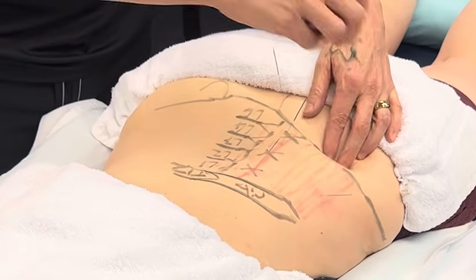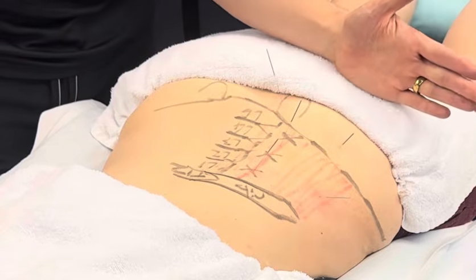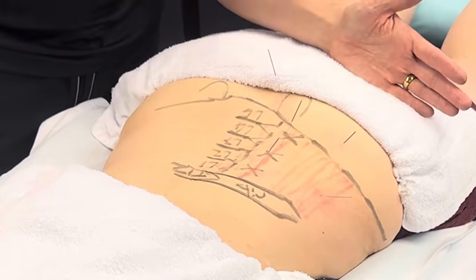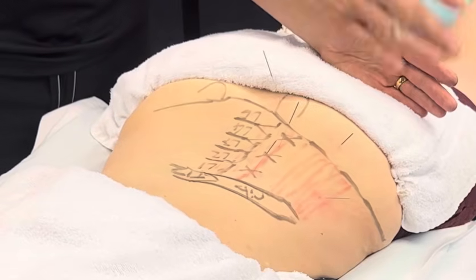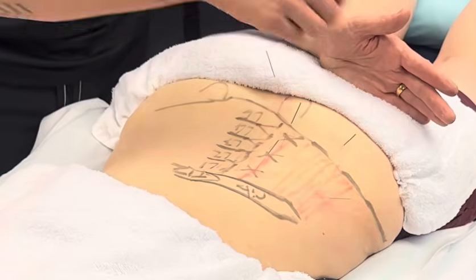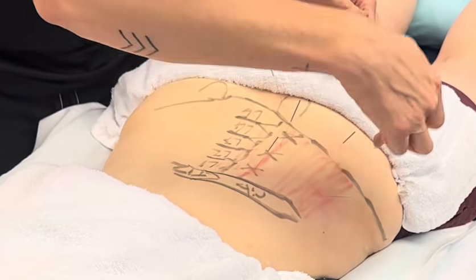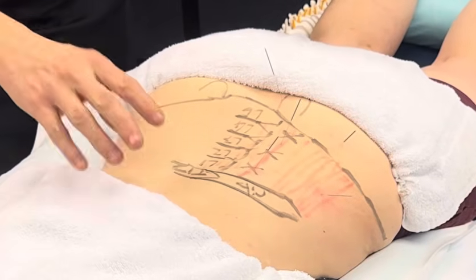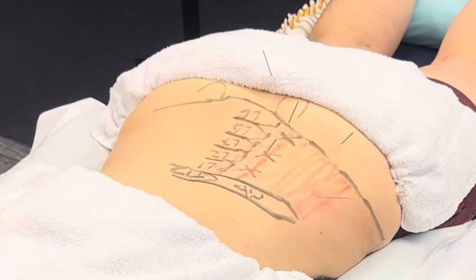and then I'm just going to bracket it and needle down until you get halfway into the butt cheek. Everything is a bony backdrop, okay? Until you get halfway down. So this ridge is totally fine. Needle, needle, needle, like all of that, right? Wherever there are trigger points. So, any questions on that?